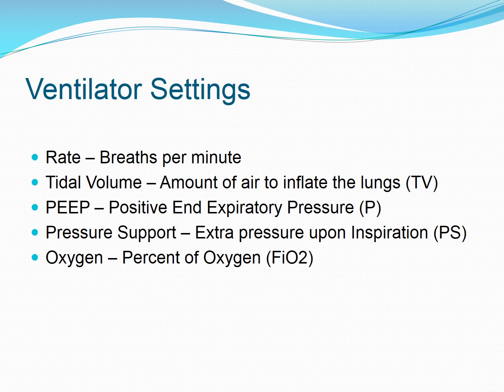Pressure support basically is just extra pressure that the patient gets upon inspiration. This is normally seen with the SIMV mode, or synchronized intermittent mechanical ventilation mode, which is used more for weaning. And the oxygen we mentioned already is the FiO2.